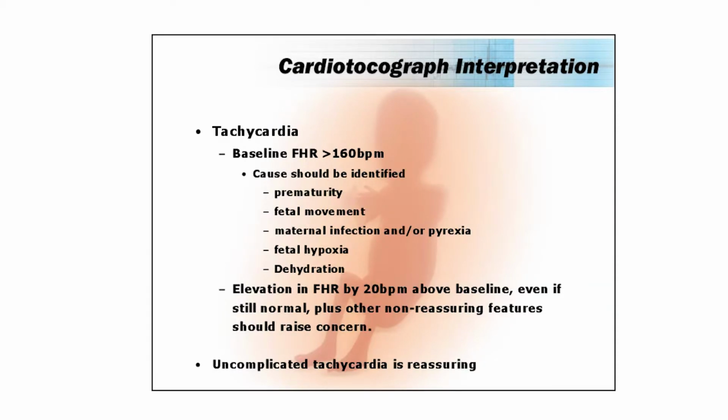And I've been asked on labour wards or telephoned, Declan, I'm sending you a tracing. This infant is 29 weeks. What do you think? I'd say, this is not good. So by any definitions internationally, this is a severely pathological tracing for term infants. For the preterm infants, I don't know how that baby is going to respond, because that baby's chemoreceptor response is unpredictable, etc. It's a very difficult one. So please be aware of that. There isn't black and white answers.